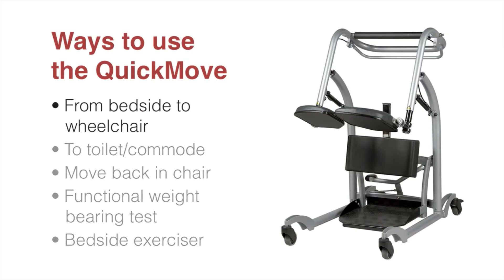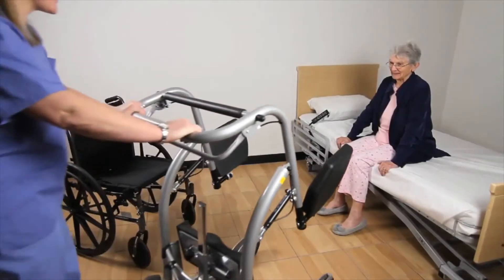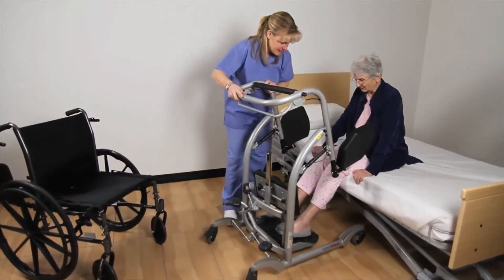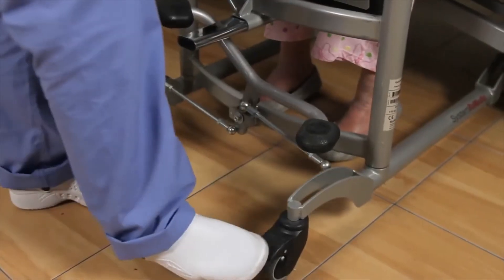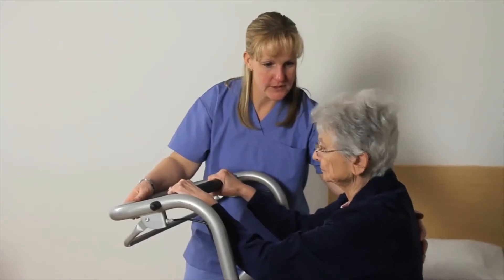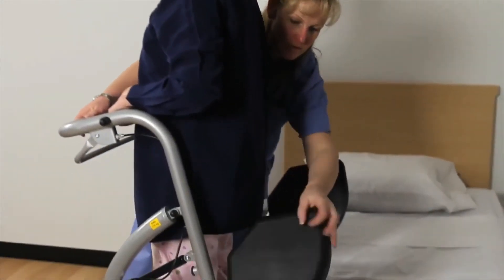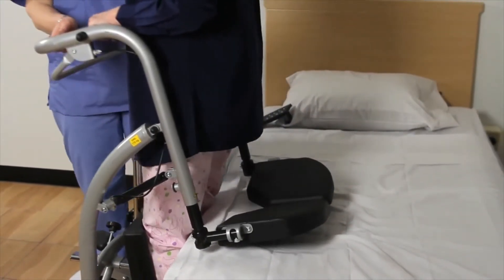We will now demonstrate the various ways to use the Quick Move. In this example, we will transfer a patient from the side of the bed to a wheelchair — a process that applies when transferring from any seated position to another. With seat cushions raised, move the Quick Move to the patient sitting on the side of the bed and ask them to place their feet on the footplate. Lock the wheels, then ask the patient to pull themselves up to a standing position.